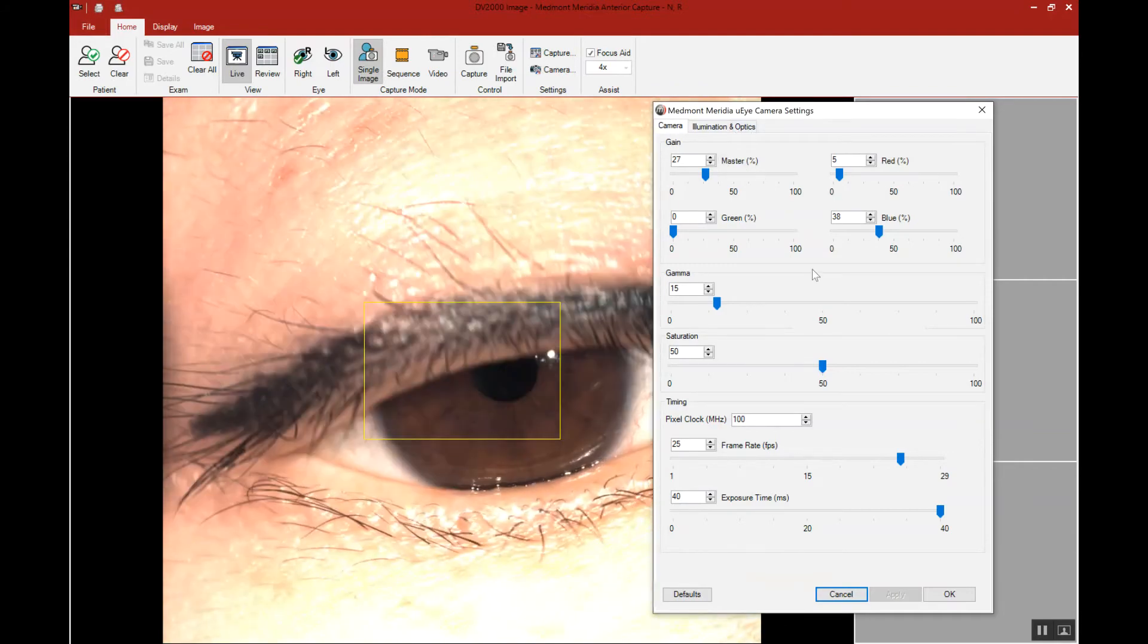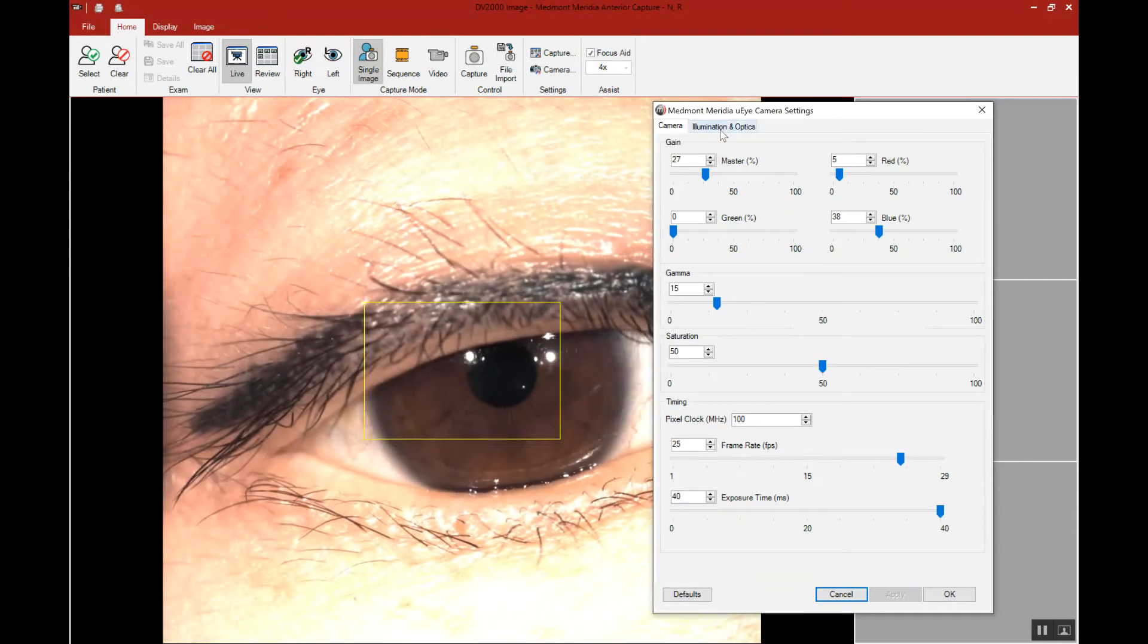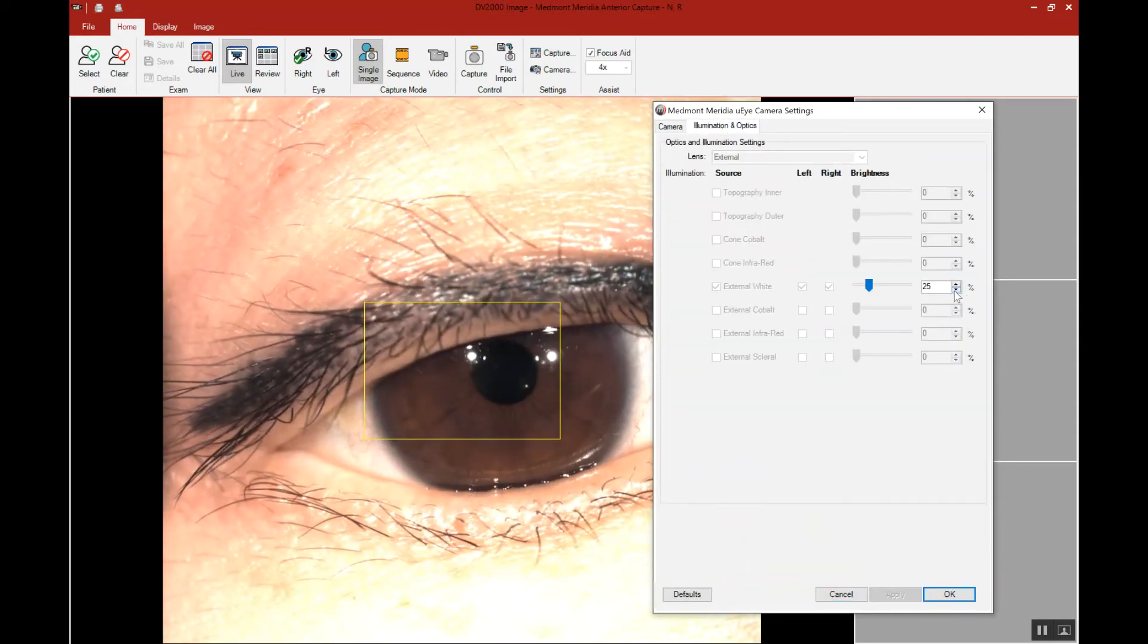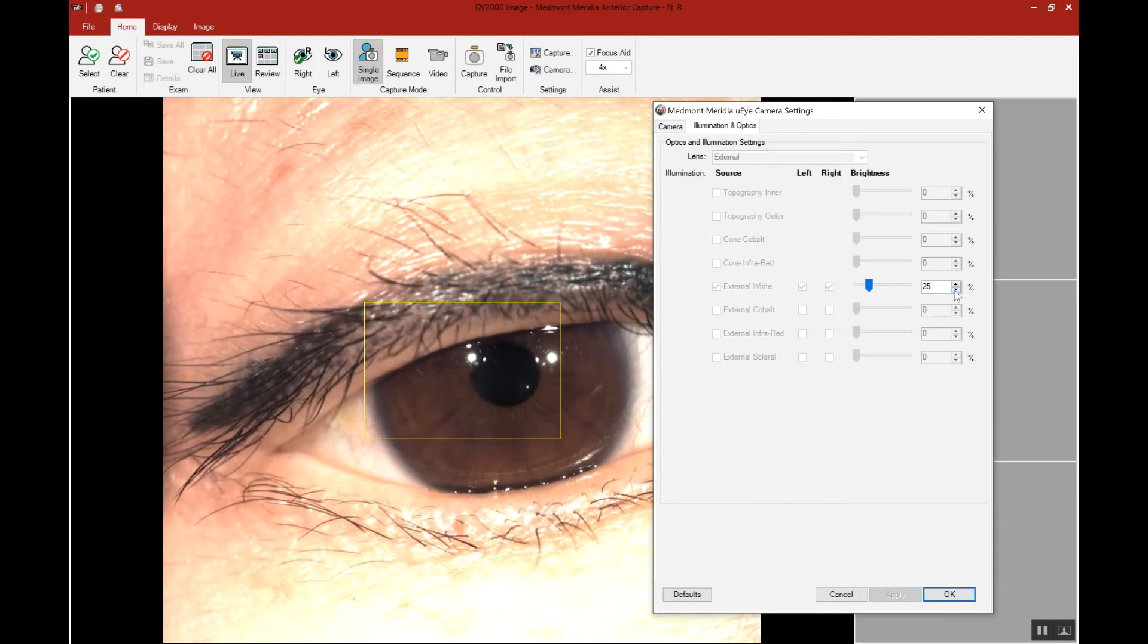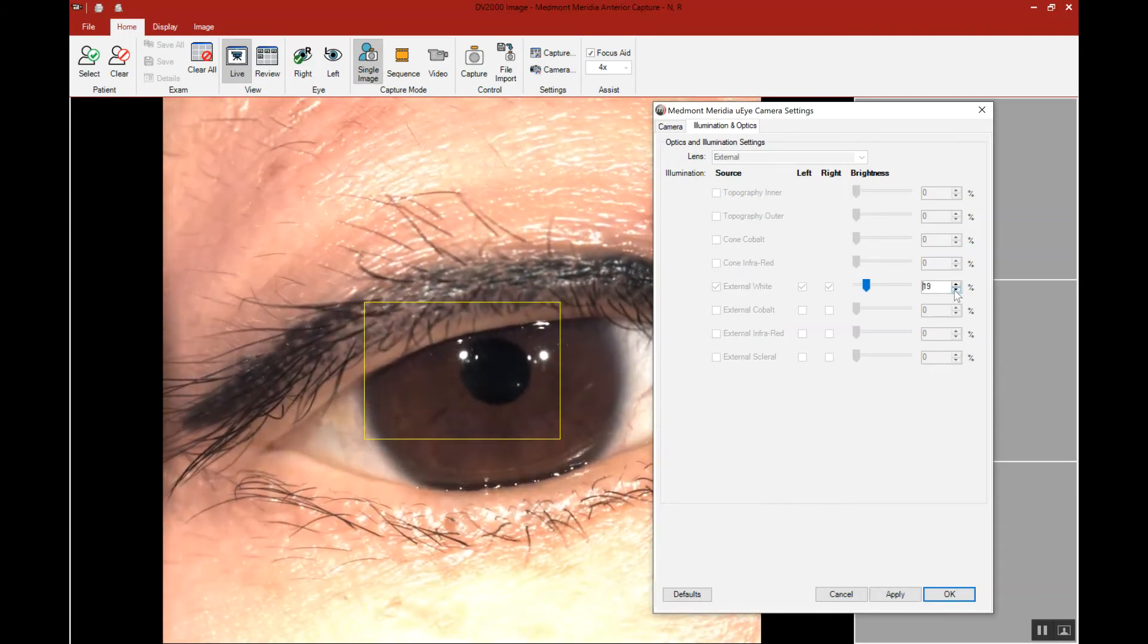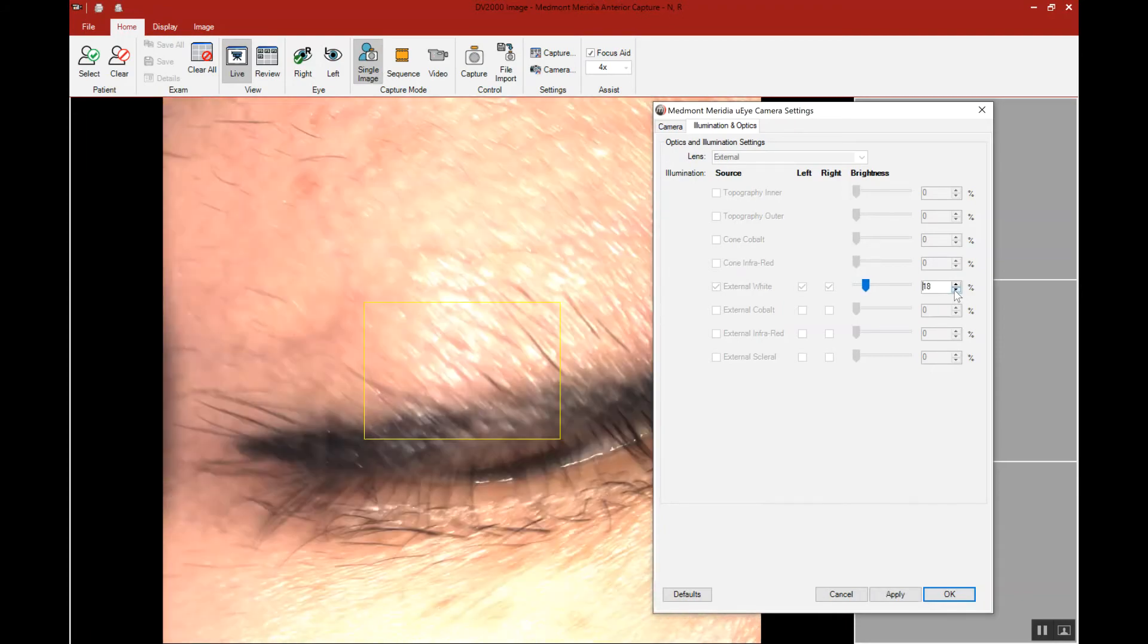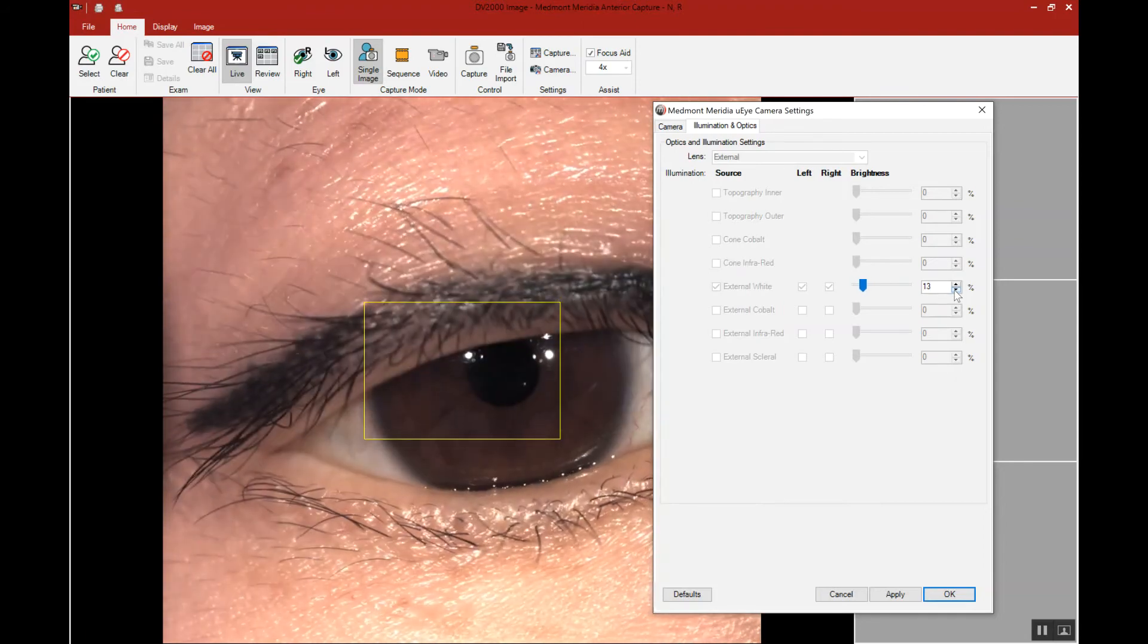Then go to the Illumination and Optics tab. Then you can decrease or increase the illumination in real-time, allowing you to observe the changes you're making to ensure this will give you the optimal capture conditions.